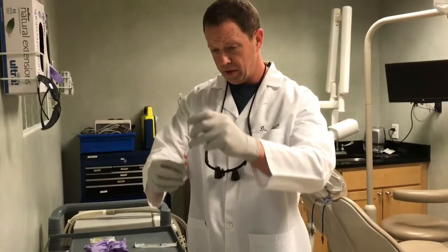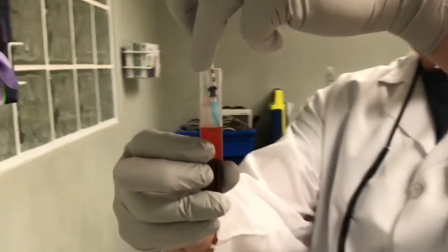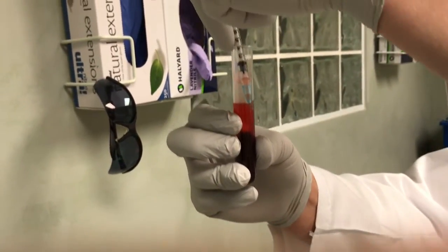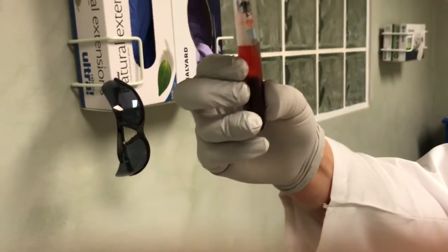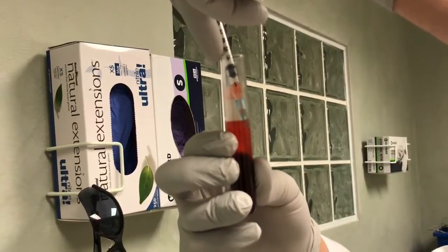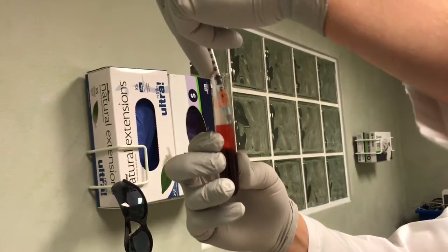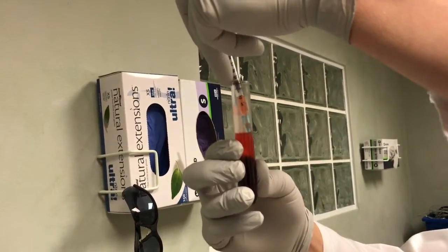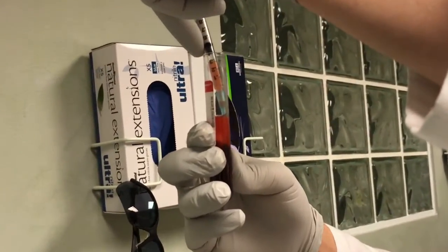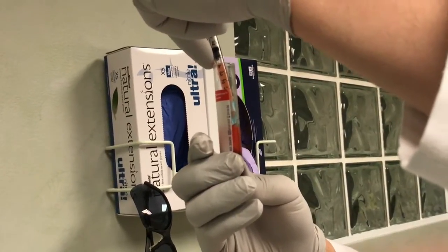I'm going to take this syringe. What you want to do is put it up against the side so you're not getting anything too thick in there. You want to draw up this yellow layer right here — this is where all the growth factors, platelets, and fibrin are. The red layer is where the red blood cells are. We don't want that.